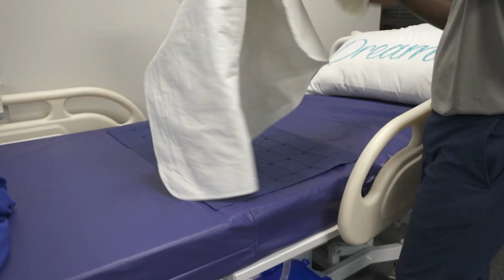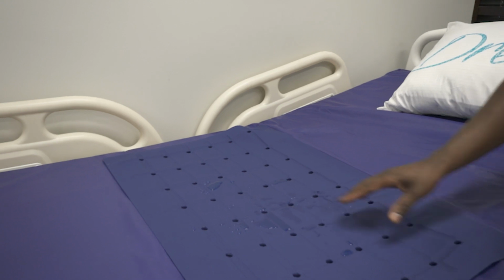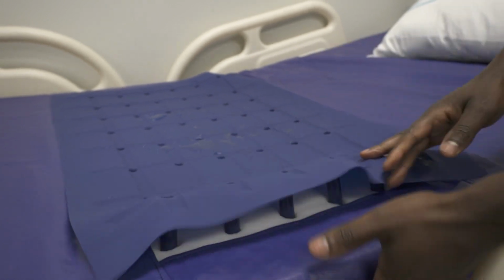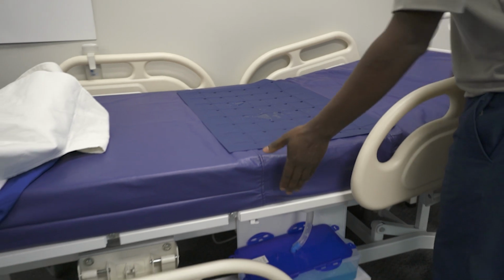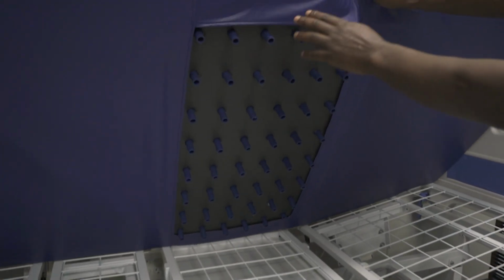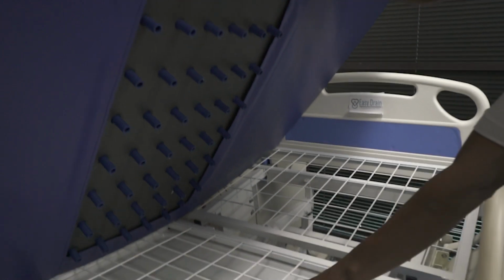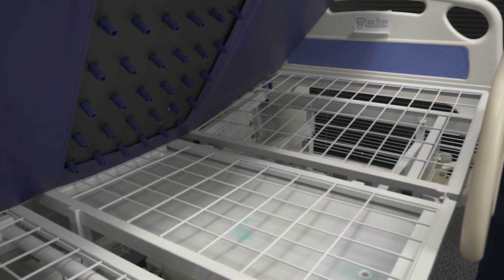This is the soaker skirt. The next is the special part here. This is silicone, which has tubings which go through the foam mattress. This foam mattress goes through to the bottom of there, so it looks like this. So these tubules go through and they are suspended here, so they don't touch this. That way you don't get to feel the pressure from the tubules.